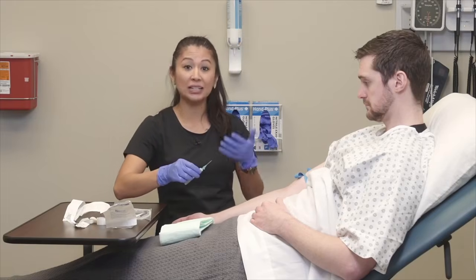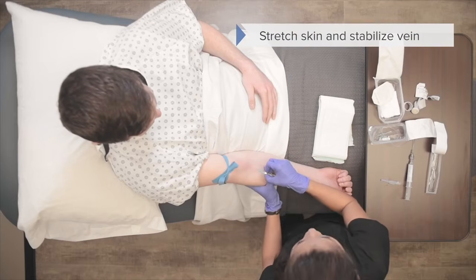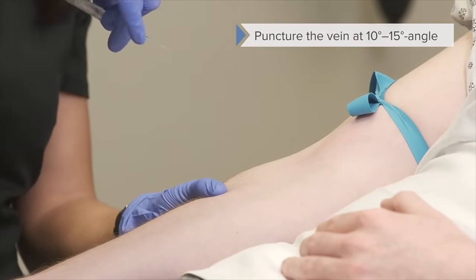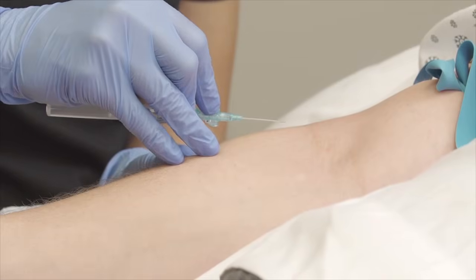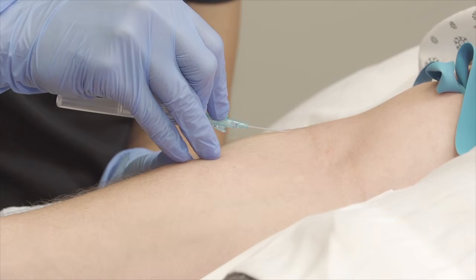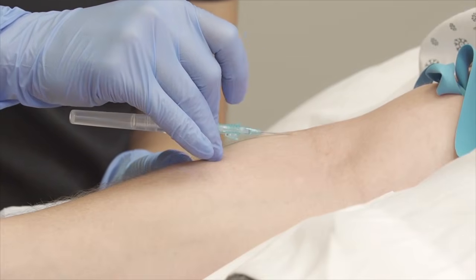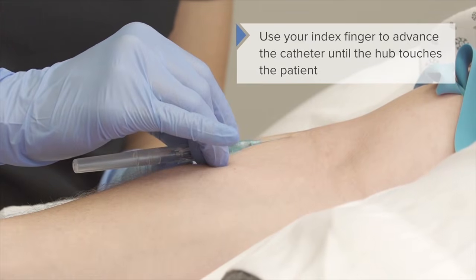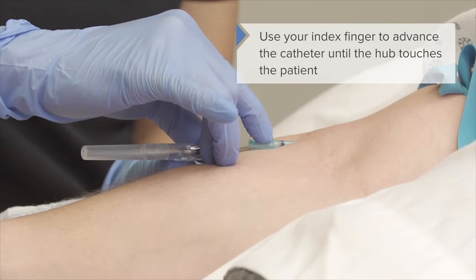All right, so now that I've cleaned, I can advance. So I need to hold my skin taut. And now when I puncture, I'm going to go at a very 10 to 15 degree angle. I don't want to go like this because I can puncture through the vein. All right, so now that I've punctured the vein, now that I'm in the vein, what I'm looking for is flash. As soon as I get flash, I want to go ahead and lower my needle, making sure it's flush with the skin, and advance the catheter firmly and smoothly all the way to the hub.